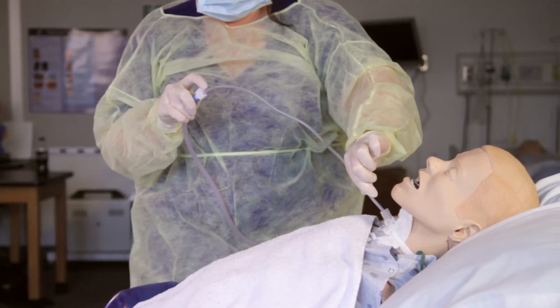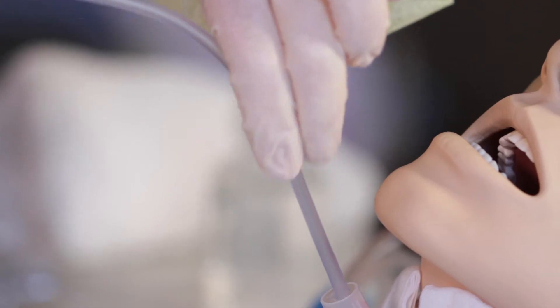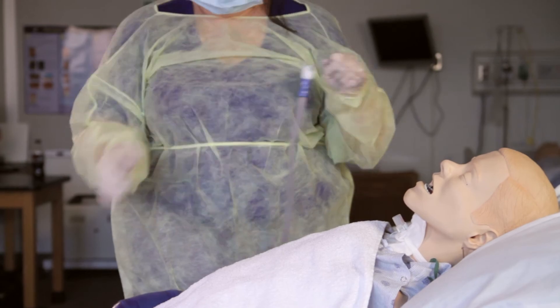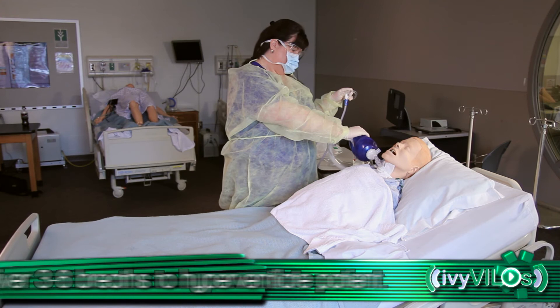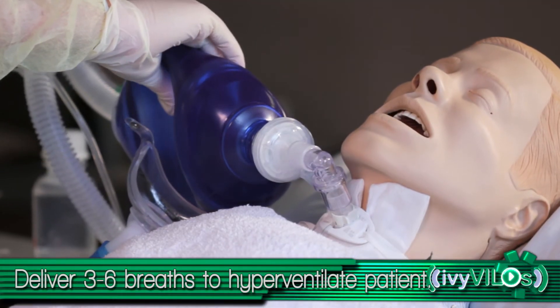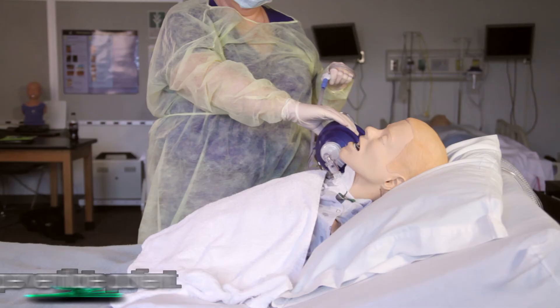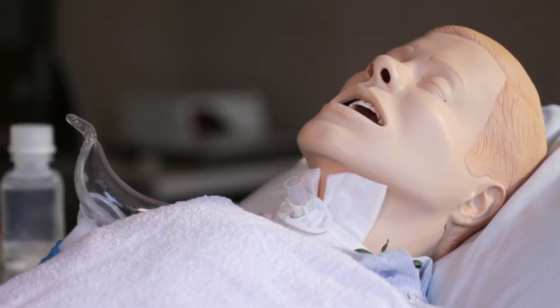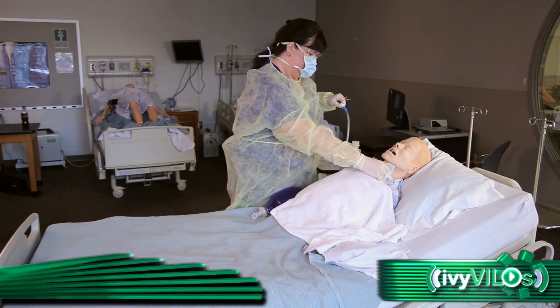Gently rotate or withdraw the catheter while suctioning. Do not suction for more than 10 to 15 seconds at a time. Use the non-dominant hand to hyperventilate the patient with the Ambu bag in the same manner again, delivering three to six breaths. Attach oxygen. Flush the catheter with saline.